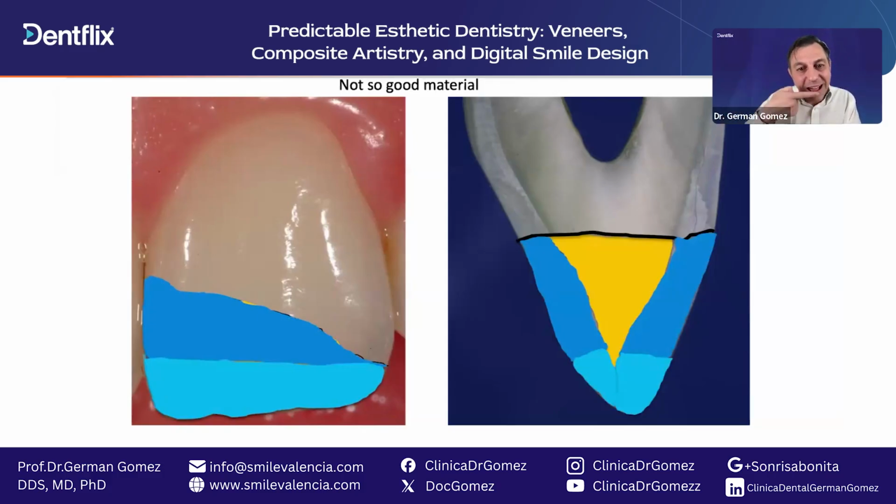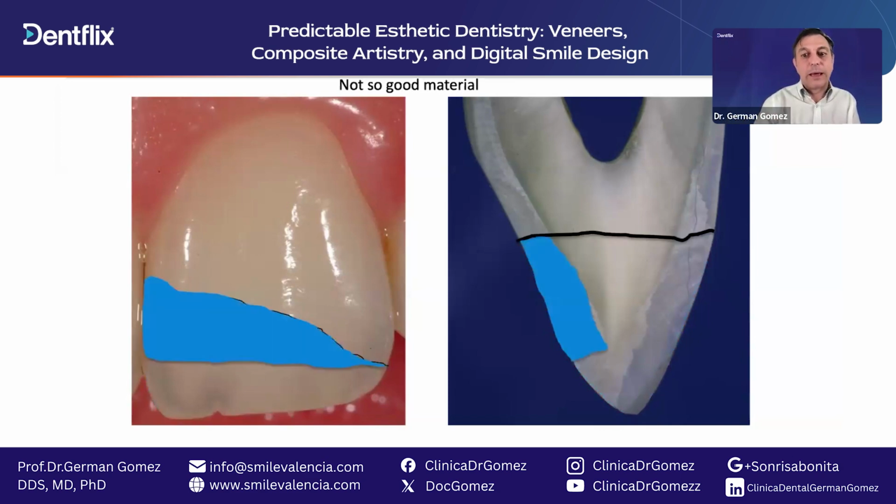Now, if we don't see the halo effect, that means this whitish line at the incisal edge, we can paint that, or we can do that with a bleaching or whitening composite.